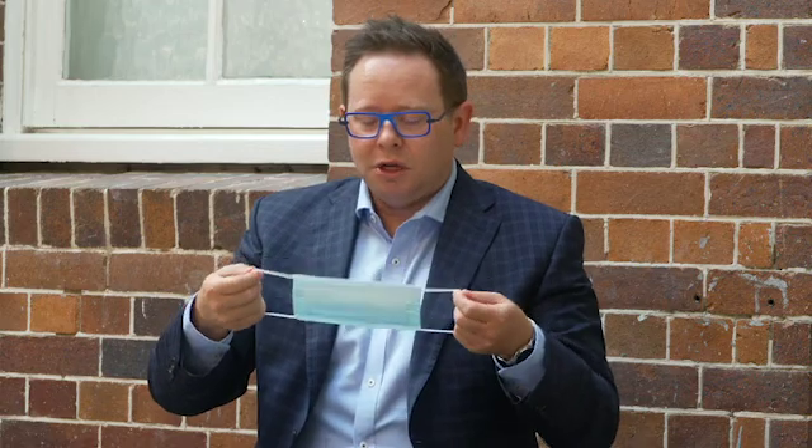Again, while putting it on, try to limit contact with the main part of the mask. And make sure it fits properly, covering both your nose and mouth.